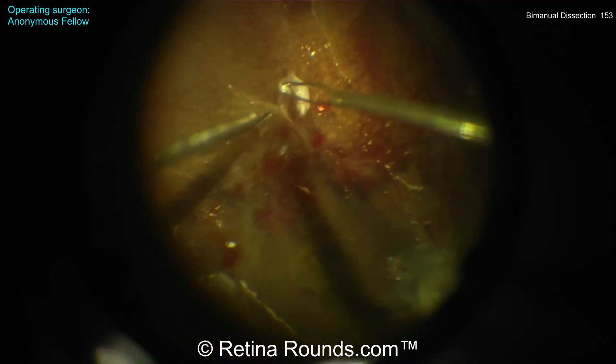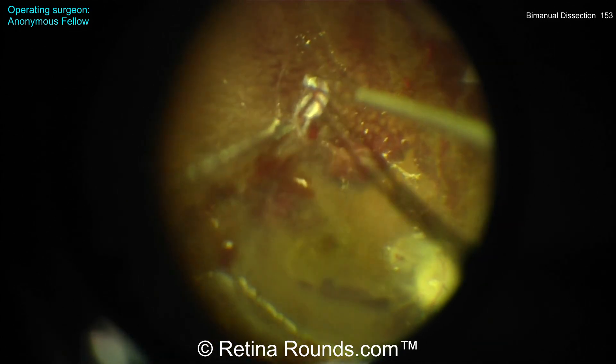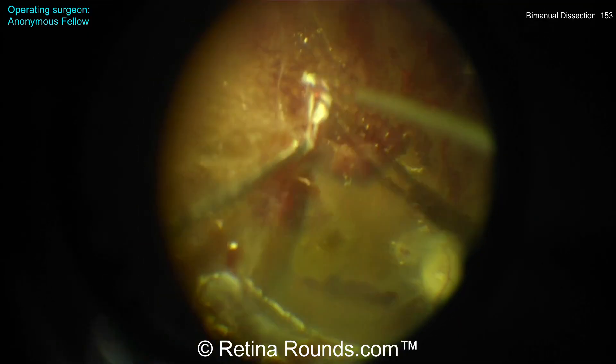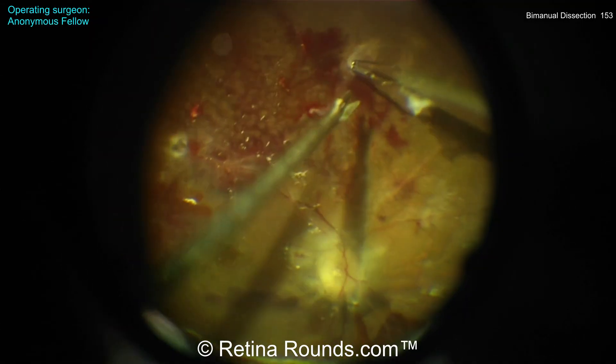What I'm noticing here is that this membrane is being pulled in more of an anterior-posterior direction rather than being pulled towards the nasal retina to better reflect back this membrane and allow for easier dissection. You can see a small iatrogenic retinal break is created there.